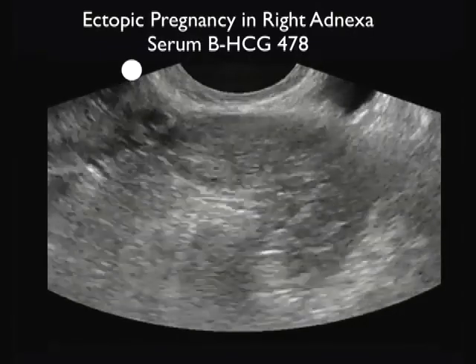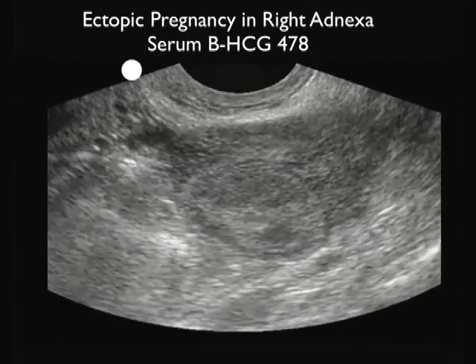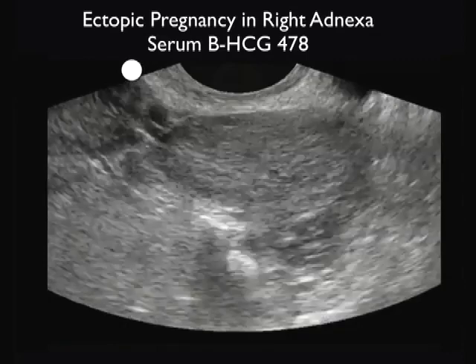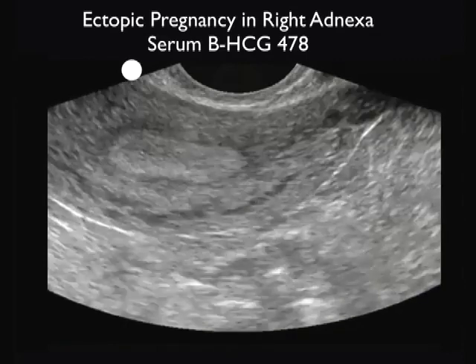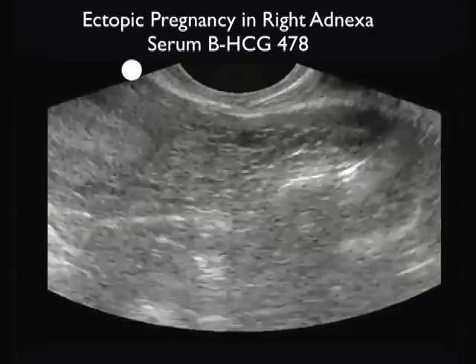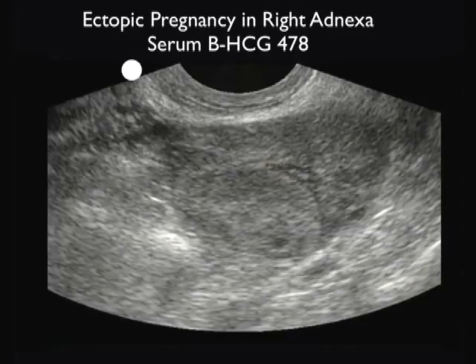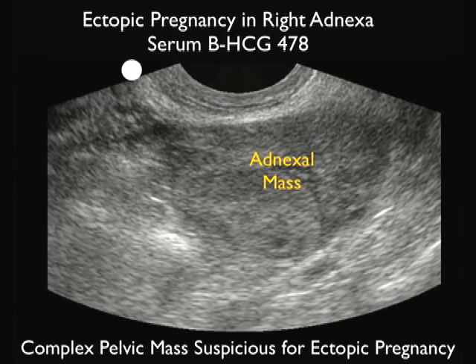Here's another ectopic pregnancy, and I'm scanning out from the midline uterus, as seen there, out towards the right adnexa. And notice there what we see is another complex pelvic mass out towards the right adnexa. Next, we're going to still that image down, and it almost looks like an egg-like appearance of a structure inferiorly within the adnexal mass. Very suspicious, again, for an ectopic pregnancy.